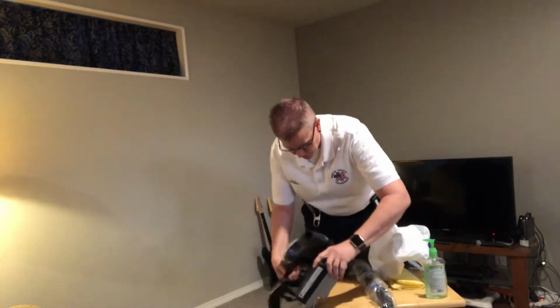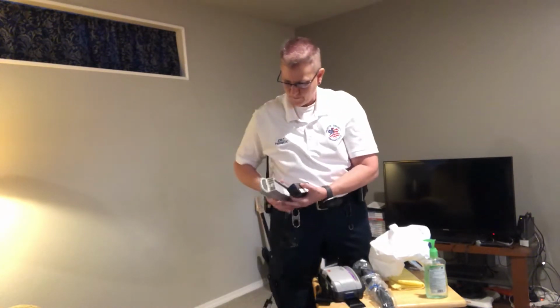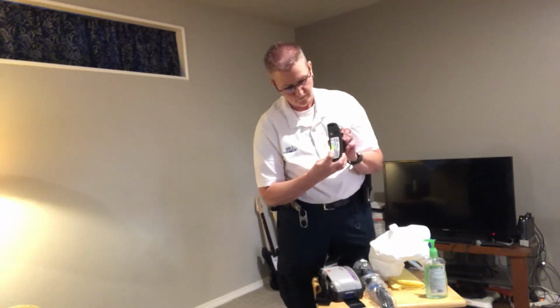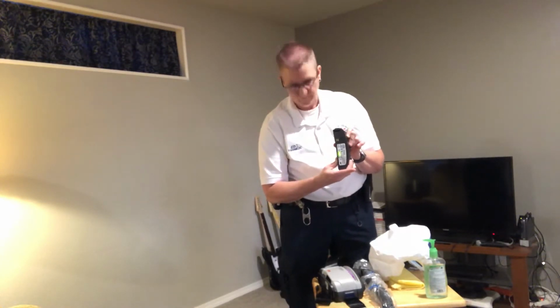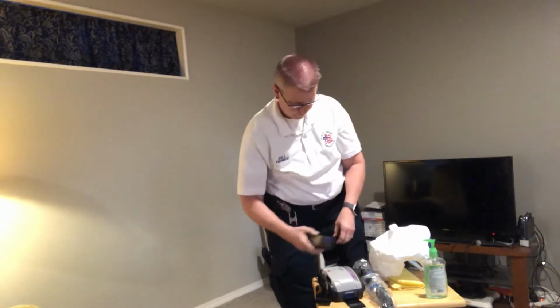When fully charged, it will go for quite a while. It should give you no problems from getting all the way through a call from start to finish, the whole shebang. There is a test on the battery itself, right there, so you can see it's fully charged. It's similar to our LifePack batteries. You just hit the button, it lights up 4 bars if it's all the way charged, and obviously goes down proportionally for what the charge is.